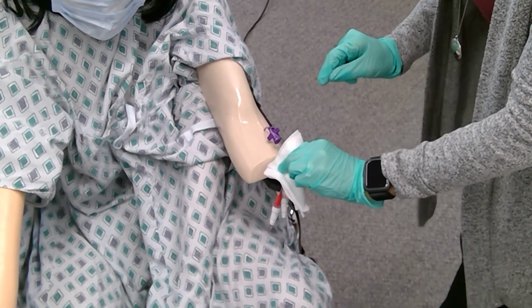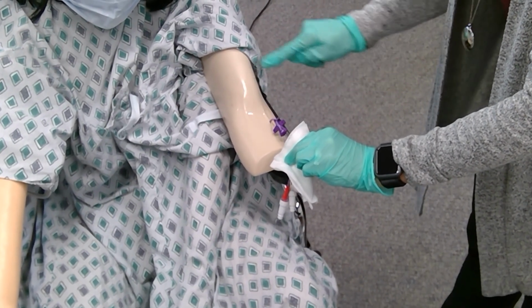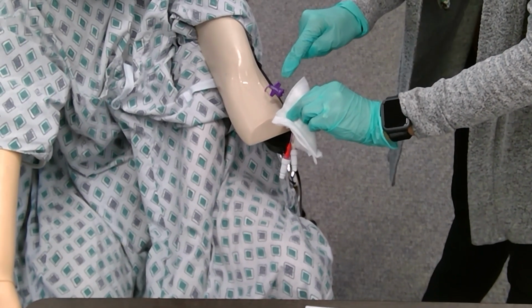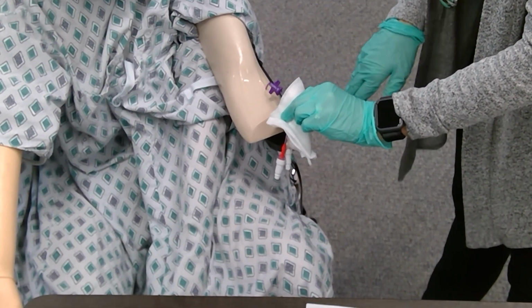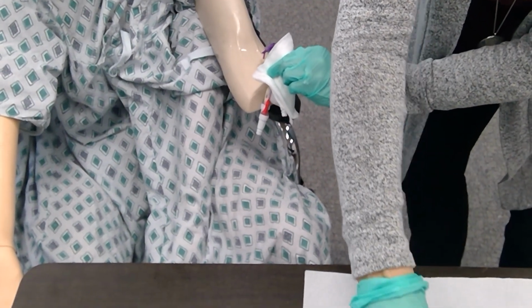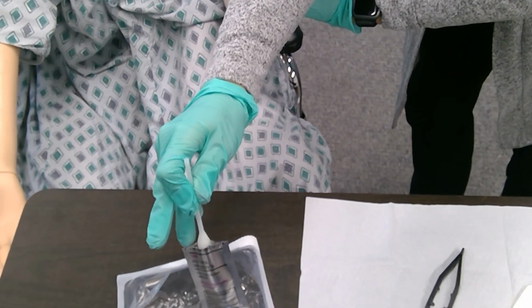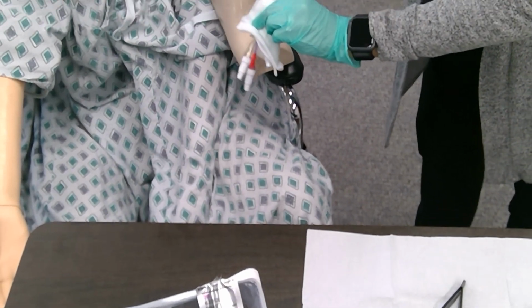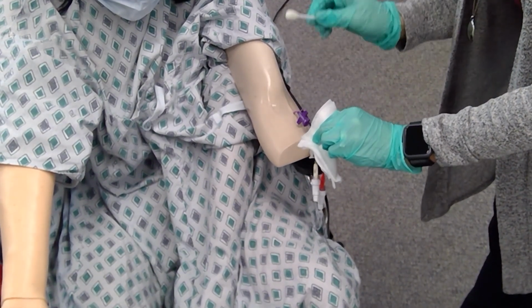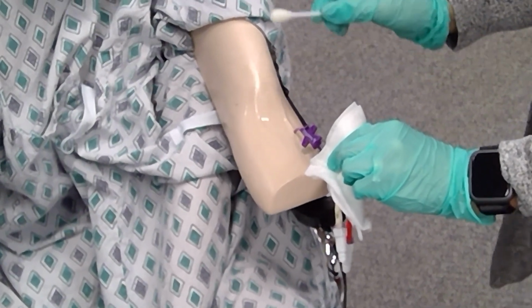Okay, now if you think about it, the insertion site is clean, some part of that tube is clean, and all the area of the skin is clean. So you definitely do not want to put the tubing back down at this point, because the tubing is still dirty. To clean the tubing, I'm going to grab my alcohol swab, shimmy it off there. I'm going to clean the line with this alcohol swab. Ideally, you're going to clean a new area with the alcohol swab with each pass.